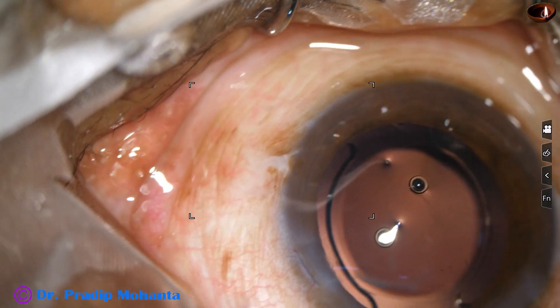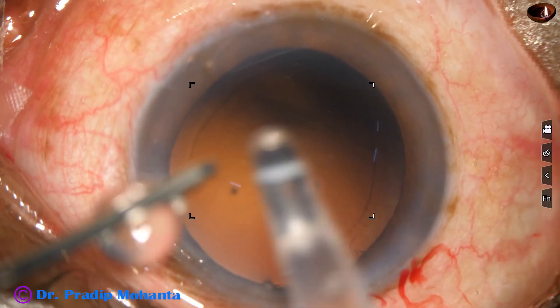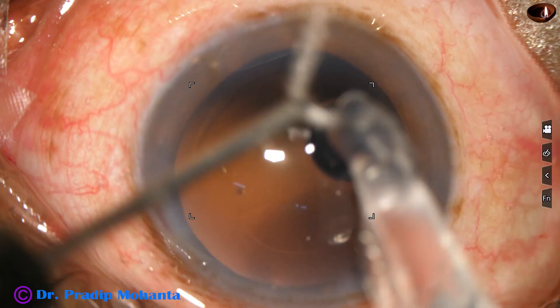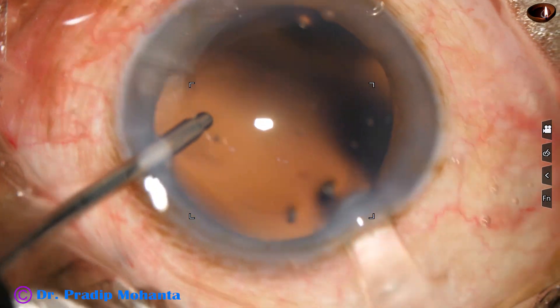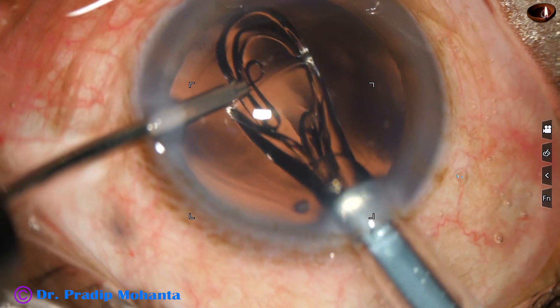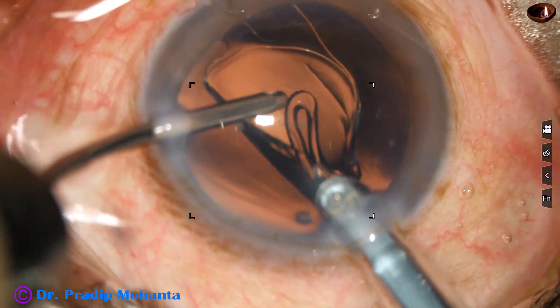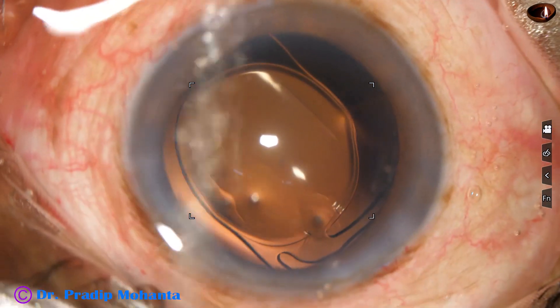I am not going to mention the names of companies. This is the last one — see how it opens. As it is injected, it opens very gently and we get time to place the trailing haptic in the bag.